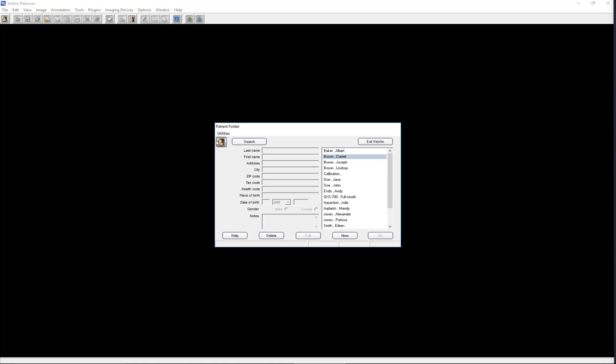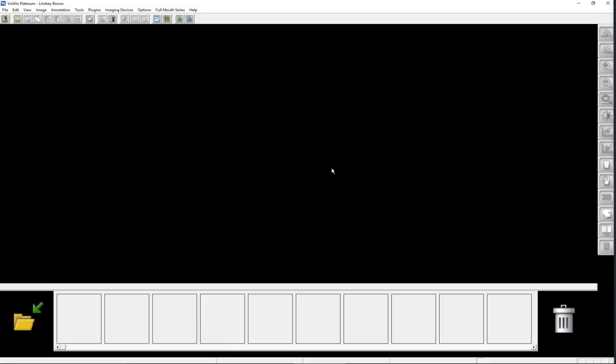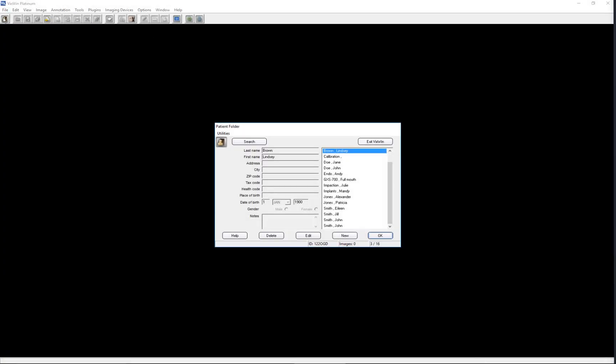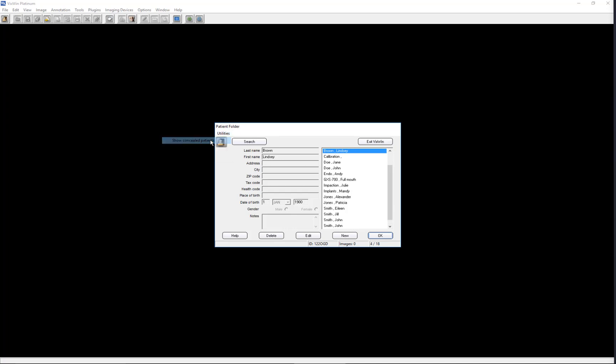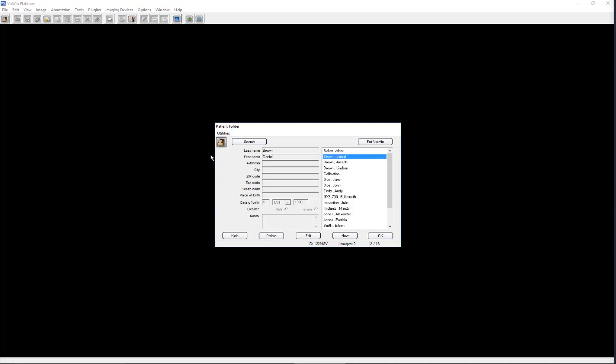However, when we exit the patient folder and return, the name is no longer visible. To permanently place the patient name back into the list, click on the Utilities button, click Show Conceal Patients, click on the patient name, open Utilities again, and select Revive Selected Patient. When we leave and return to the patient folder, the name will remain visible.